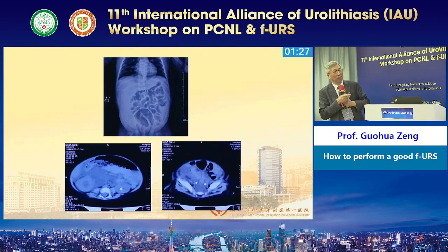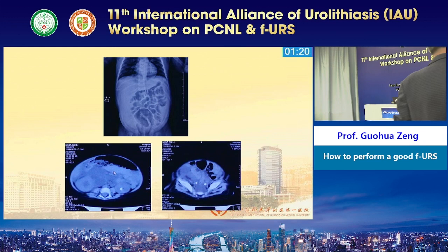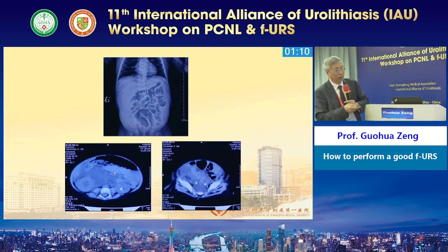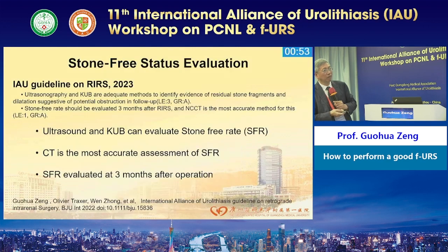This is a 5 months old. You see, this bilateral ureter stone is here, and this is a left side lower pole stone. And for this, first remove this bilateral ureter stone and put a double-J stent, and the ureter dilated, and then I do it. This is a small case. I use this, and for this do it. This is a post-operative CT scan, no stone left.